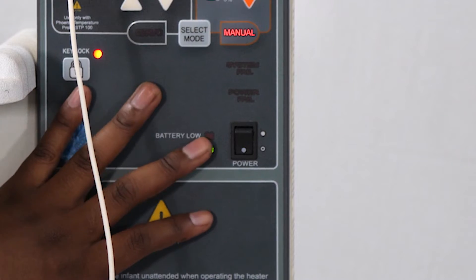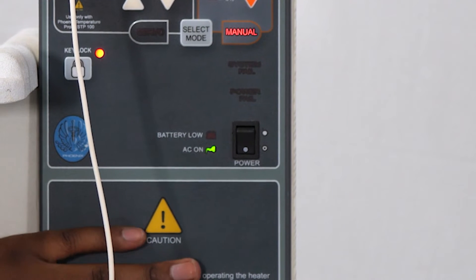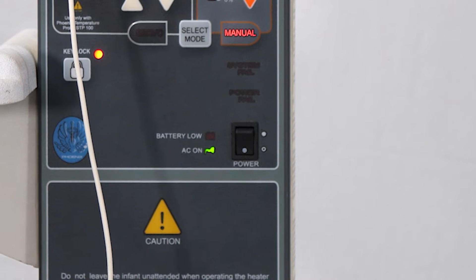So right now it's showing us a green light. Next to the switch, a green power icon shows you that the machine is on and using mains power.